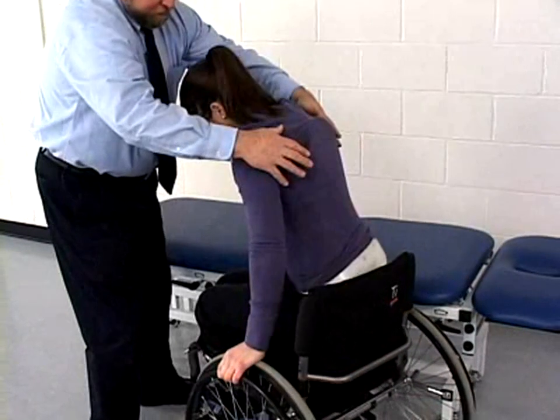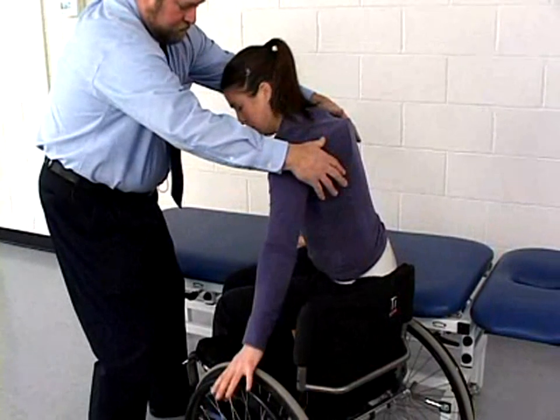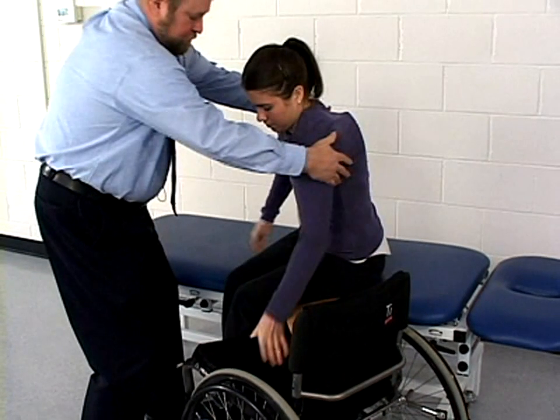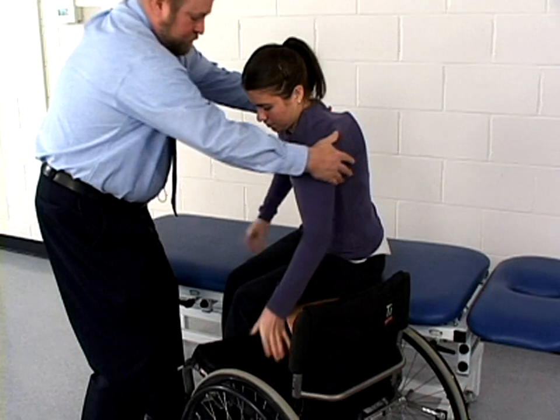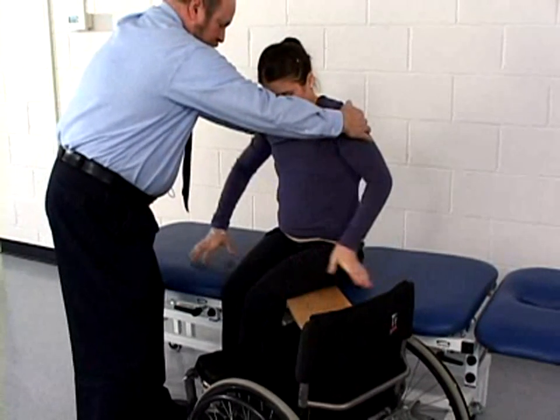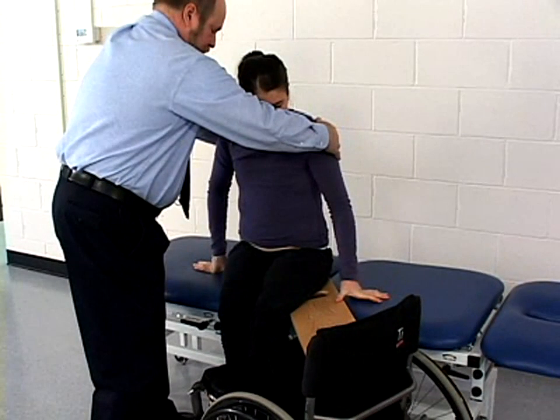Using a series of push-ups, the patient transfers to the treatment table. By straightening the upper extremities and depressing the shoulders, the patient lifts her body, sliding her buttocks toward the treatment table, and then lowers herself back onto the sliding board. She then repositions her hands and repeats the sequence until she is on the treatment table with only one buttock remaining on the sliding board.